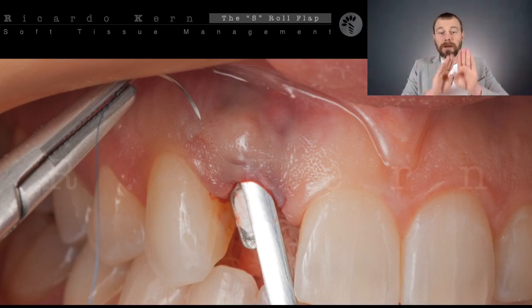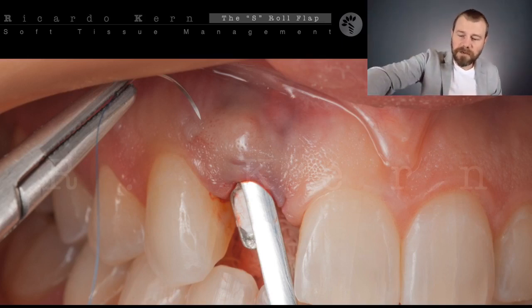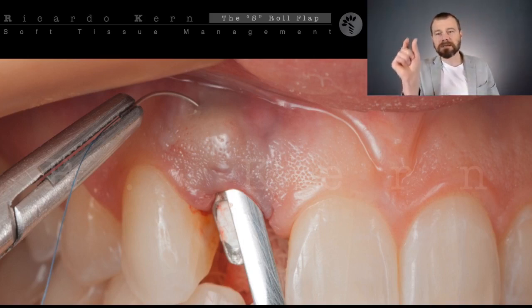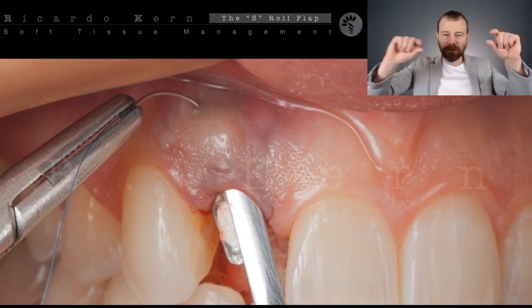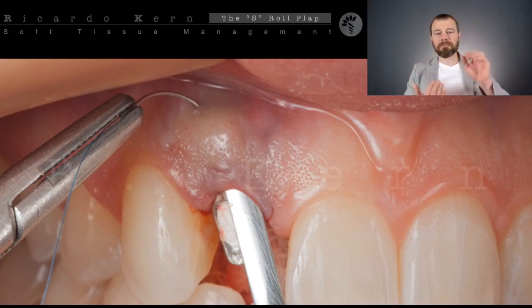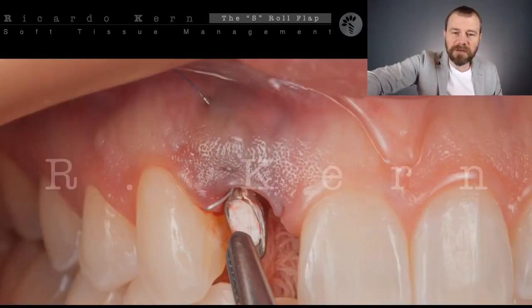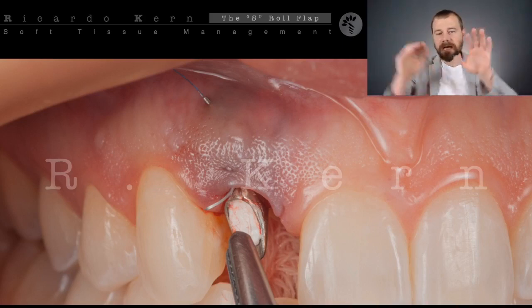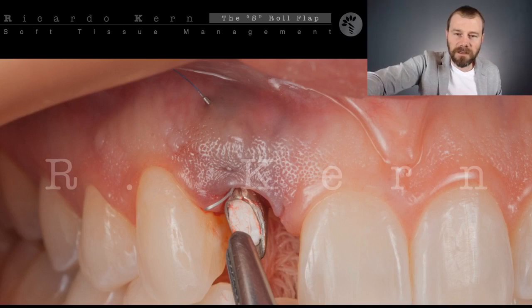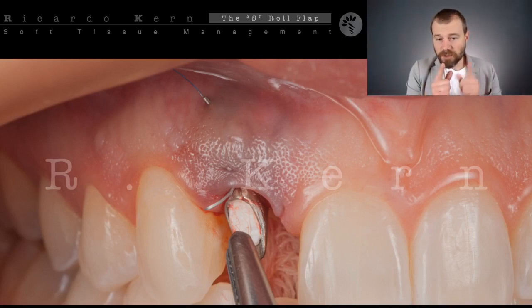So we're going to bring now the graft in place with sutures that start in the apical part. We align this graft vertically, not horizontally. I do not need to bring this graft under the central incisors or the canine. And here we use a blunt instrument, it can be a probe or something like that, to open the space for your needle to run between the bone, the threads, the residual periosteum, and the flap without engaging anything in the way.